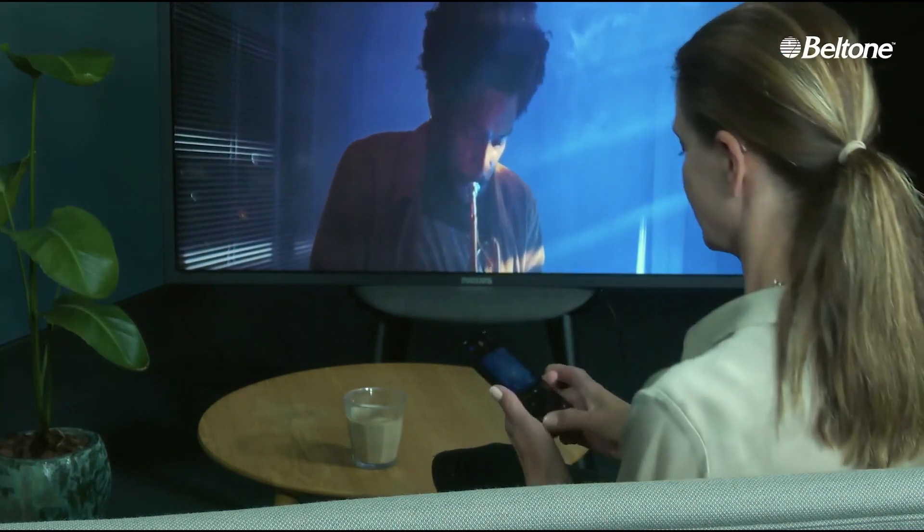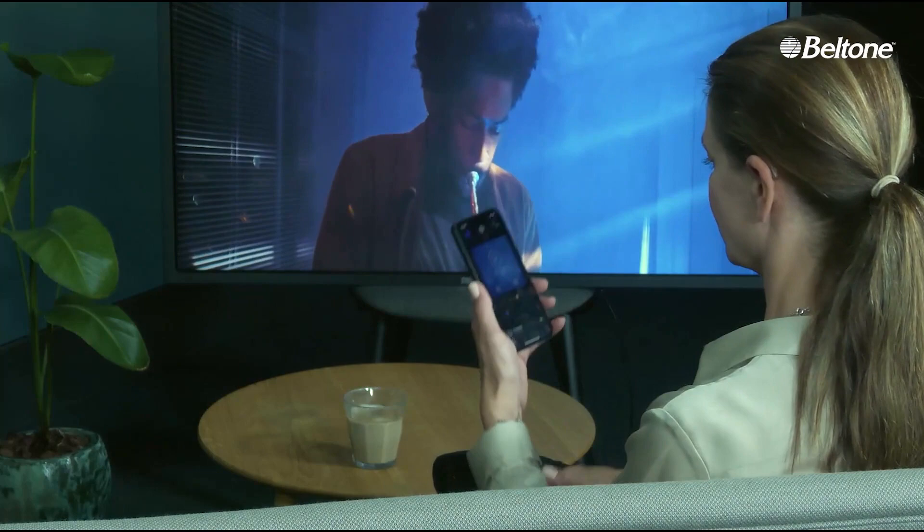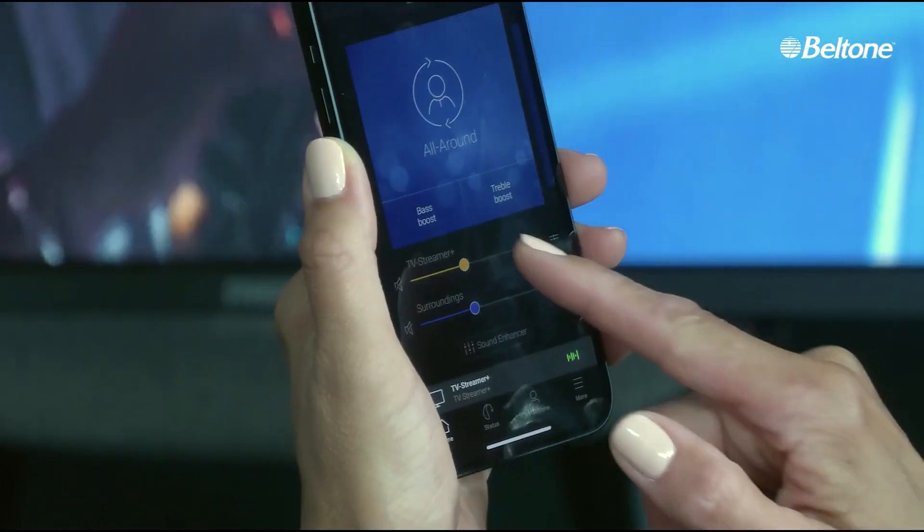Back view of a brunette woman with a ponytail, wearing a hearing aid behind her left ear and sitting on a sofa. She is watching a man blow a trumpet on the TV screen in front of her. There is a glass of milk and a cell phone on top of a coffee table between her and the TV, and a tall green plant to the left of the table. She picks up her cell phone with her right hand, transfers it to her left hand, and looks at the phone screen.